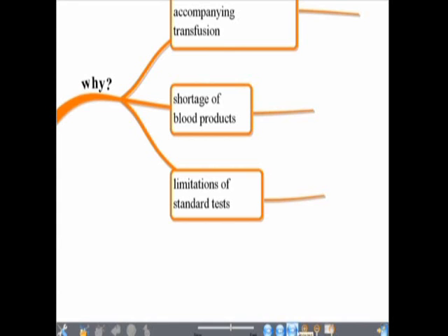Apparently the guy who was giving us a talk at Glenfield was saying that these tests weren't actually designed for what they're used for now. They're designed for something else, but we've started using them to test the coagulation of blood. Whereas this is specifically designed to test not only the dynamics of the blood, but also the kinetics of blood coagulation.